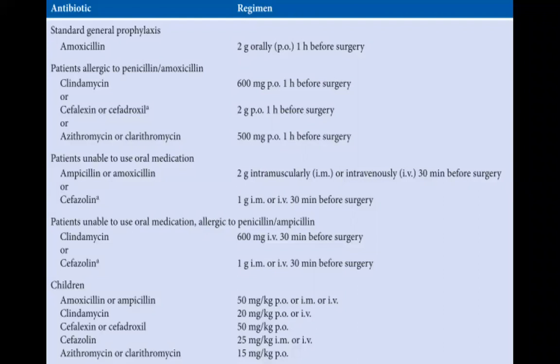You have to start with antibiotic prophylaxis. That's for sure, because antibiotic prophylaxis prior to the surgery is something very important. I think you have this slide, this table, so you can step to your screenshots.